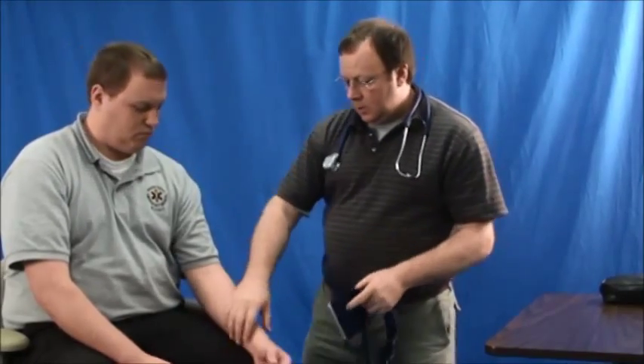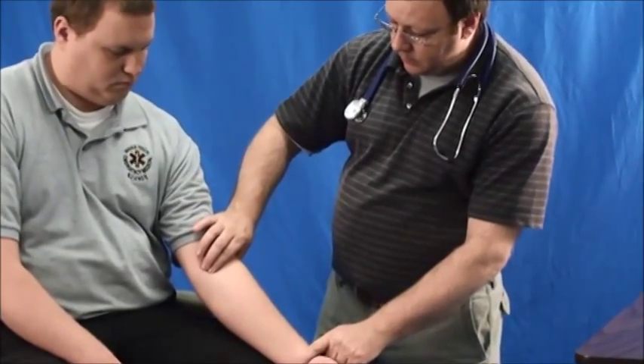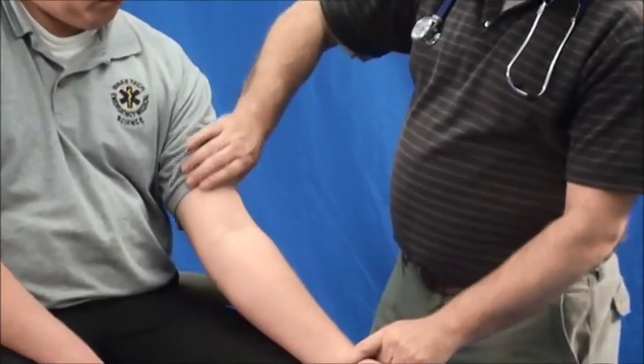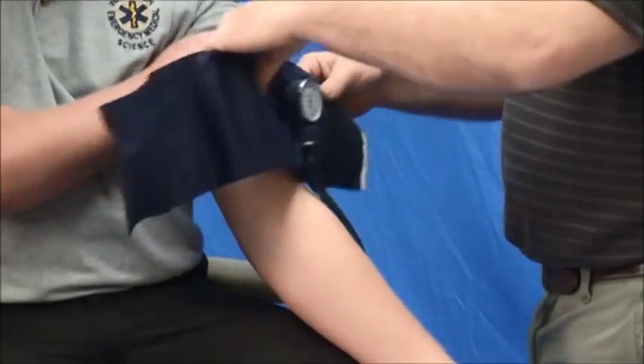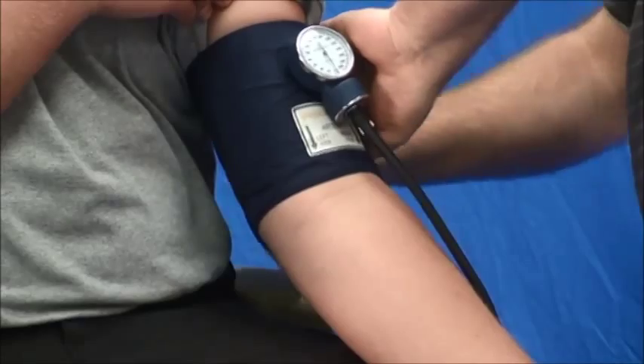This is how you auscultate for a blood pressure. First, have your patient in a seated position. Locate the brachial pulse. Expose the arm and place the blood pressure cuff with the arrow directly over the brachial artery.